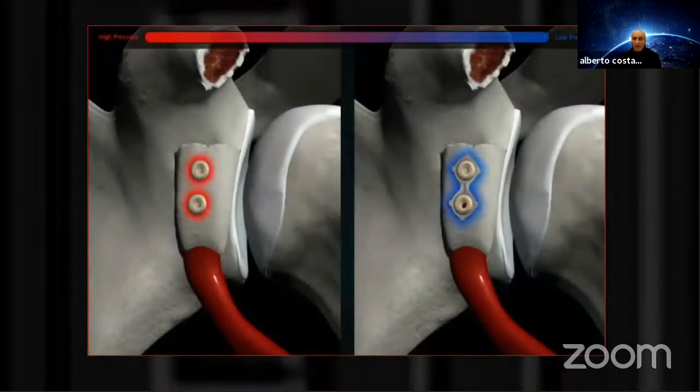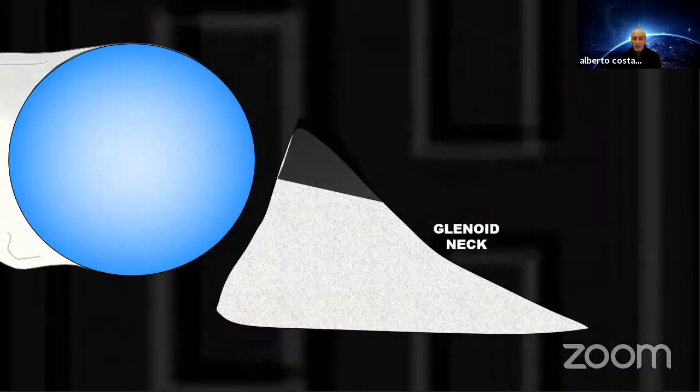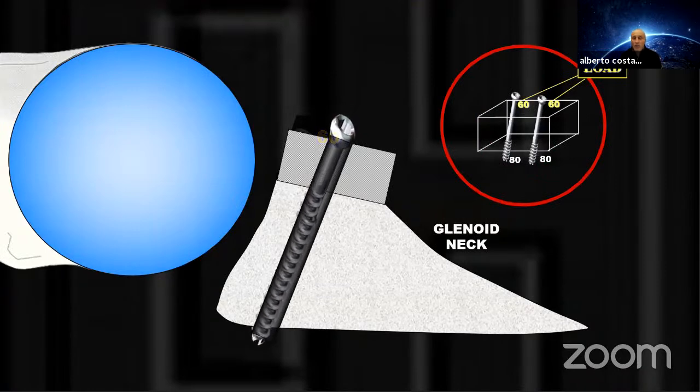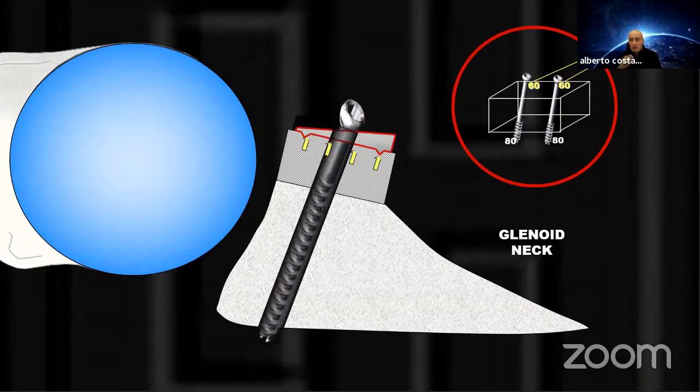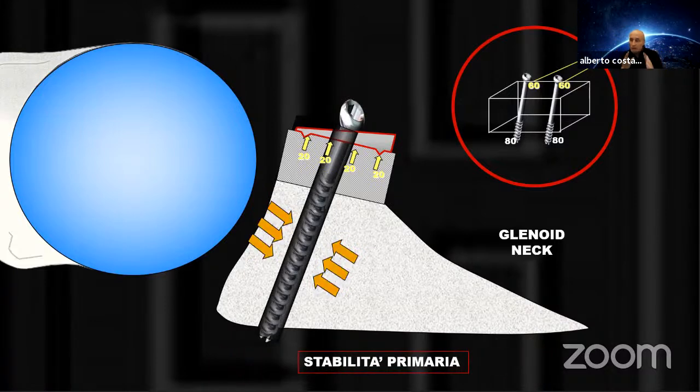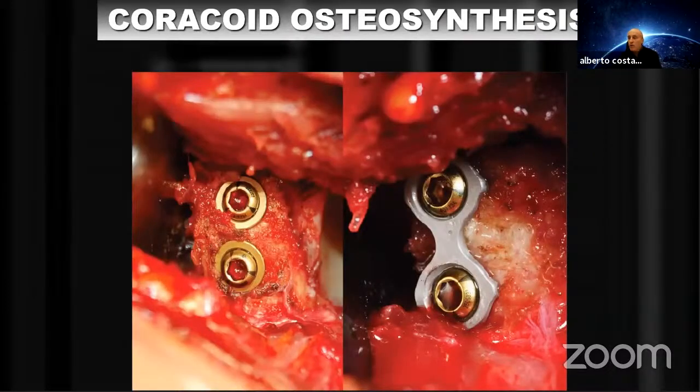And also, we have another reason, because not only for compression, but also for stress shielding, we use the plate. Without a plate, we may encounter one of the terrible intraoperative complications of the screws, that is breakage of the graft. If we put a screw, we may put too much force on the head of the screw. Instead, if we dissipate the force over a bigger surface, we have more surface of contact and more spread of the force along the graft. But obviously, you can do the Latarjet the way you like. That's no problem. This is just one person's thought.